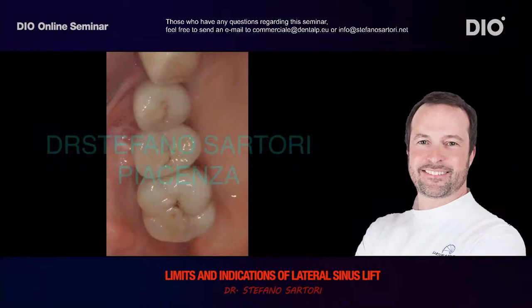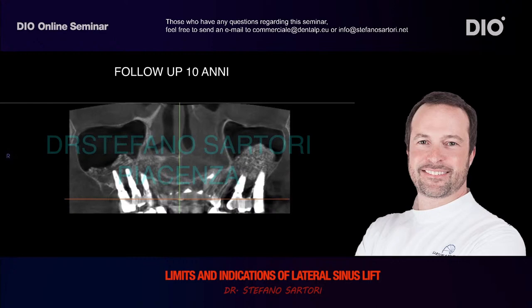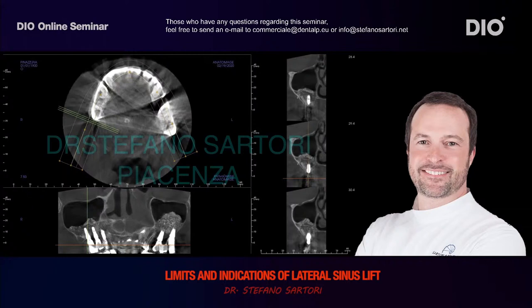This is another occlusal view of the restored case, but look at the case after 10 years. Look, this is the cortical bone, the corticalization of the bone. Look at the stability of the tissues, of the buccal tissues, after 10 years. But what I want to show you, and it is very important, is what happens to that block bone that we had positioned to close the wall.